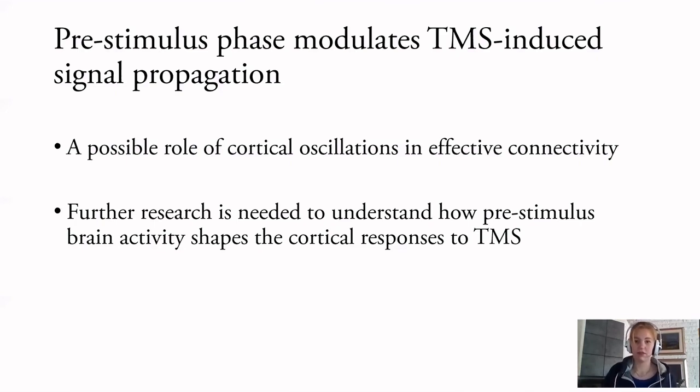These results still give new insights into the role of cortical oscillations, and it's especially important for future closed-loop and brain state-dependent TMS paradigms, which reduce variability in studying cortical networks. And the possible future closed-loop stimulation paradigms will be vital for individualization of clinical applications of TMS, as well as for making treatments more efficient.